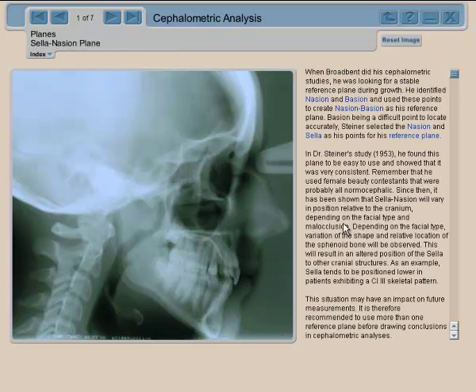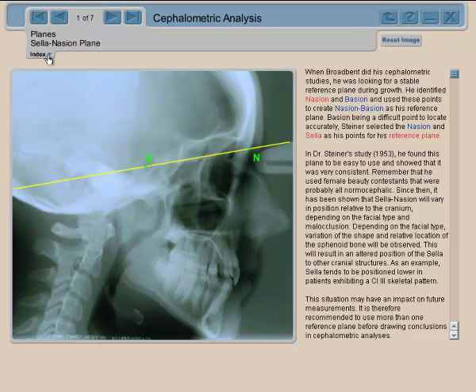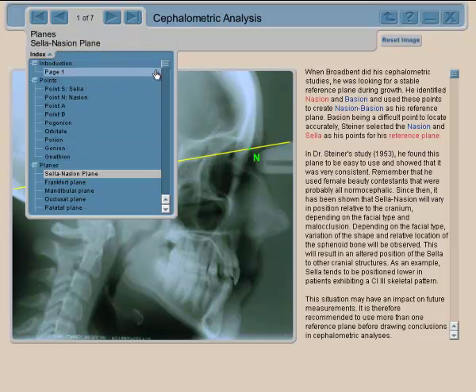I selected Sella-Nasion, and I got those two points, so that's the plane. When you join two points you get the reference plane Sella-Nasion, which happens to be the reference plane from the Steiner analysis.